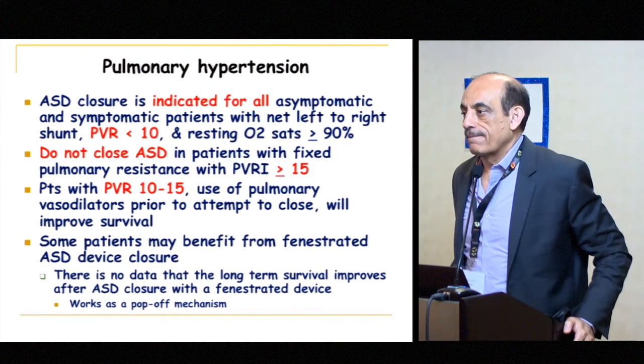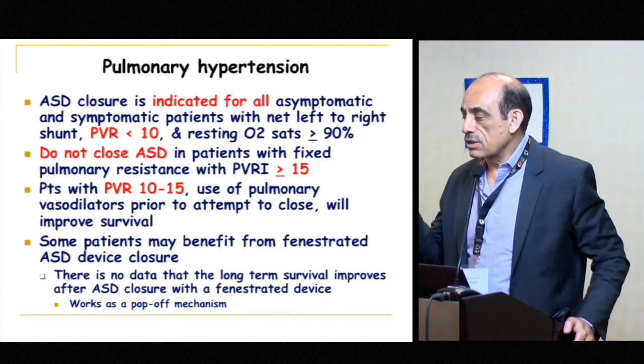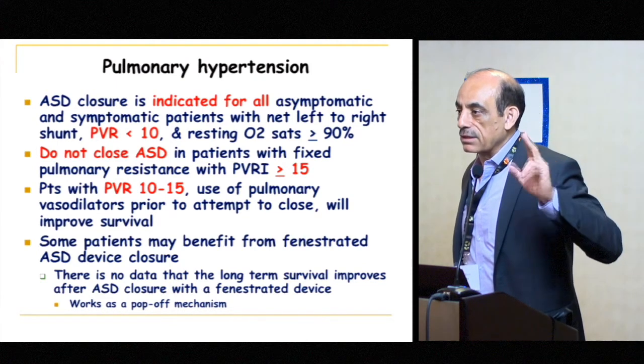So you base it off a static TE? So I base it off of transesophageal or intracardiac echo in 3 views. There is no way I will do any ASD without looking in 3 views: 4-chamber, short axis, and bicaval view. And then we get the average diameter.